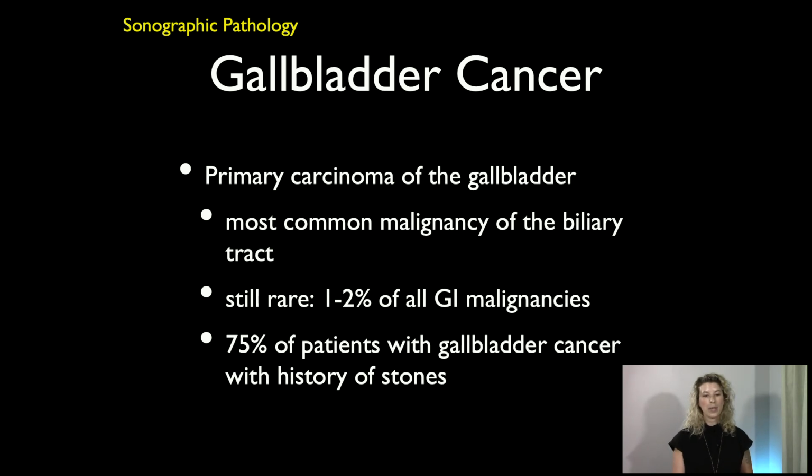Gallbladder cancer is something to mention, but it's definitively outside the scope of point of care ultrasound. You may find incidental things that could lead you to think that you were looking at a patient that had gallbladder cancer, but this is not something that we would diagnose at the bedside. It's still pretty rare, even though it's the most common biliary tract malignancy. Patients that have it typically have a history of gallstones.